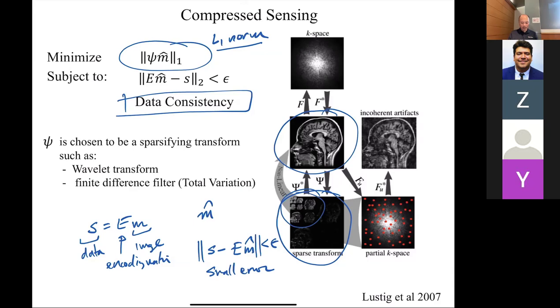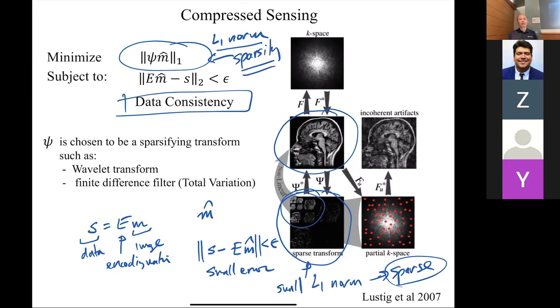Okay. Another way of saying this is this has a pretty small L1 norm. Okay. L1 norm, you can think of it as the sum of the absolute values of all the coefficients. And so it's a good proxy for how many coefficients you have, right? And so this has a small L1 norm as compared to the image. Okay. So another way of saying it is it's sparse. It's a pretty sparse representation. So this is going to enhance sparsity. Okay. So that's my first way.